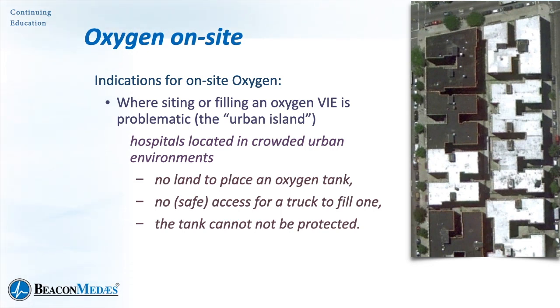Maybe the land that we want to put the big white tank on is in fact so valuable and we'd rather put a 10-story patient tower on it. What then? Well, there's another case where we might want to think about, rather than having oxygen delivered, we would actually have it produced on site.